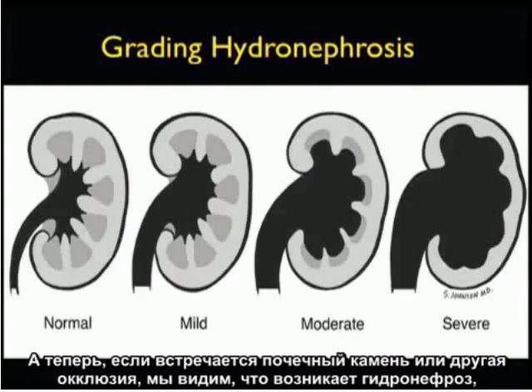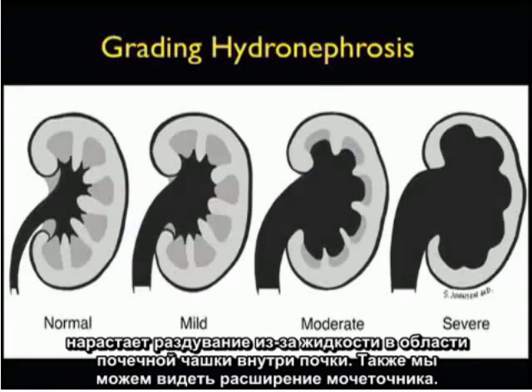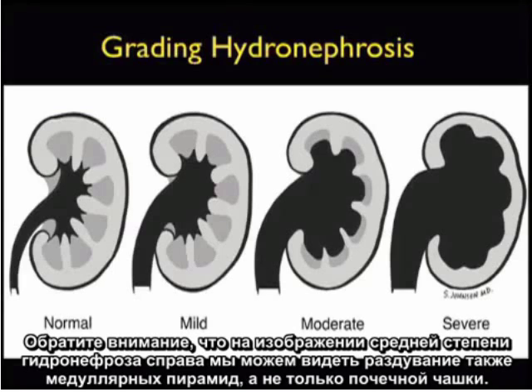Now, if a kidney stone or other obstruction type pattern had occurred, we can see that the hydronephrosis would be manifested by increasing ballooning out of fluid within the calyceal region of the interior part of the kidney. We can also see dilatation of the ureter. Notice in the moderate type picture here to the right, we can see ballooning out of the medullary pyramids in addition to the calyces.